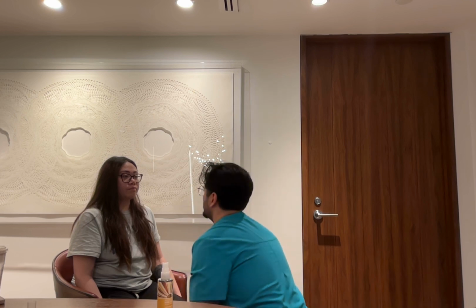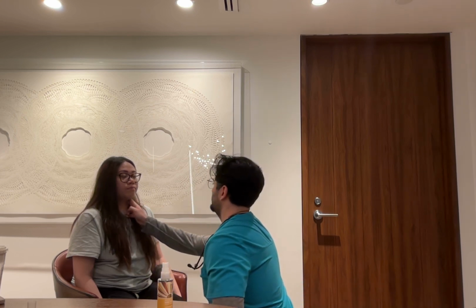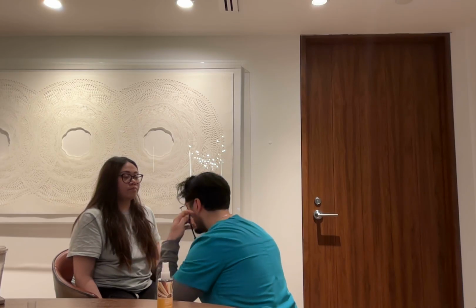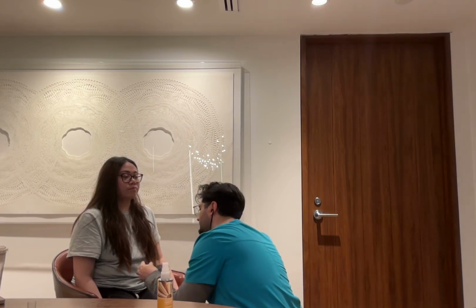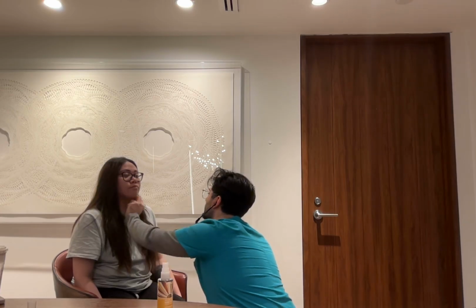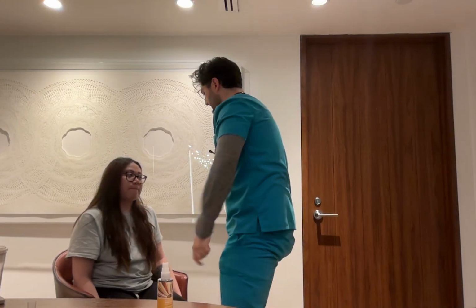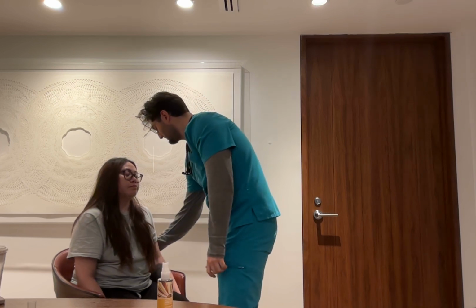No abnormal pulsations noted. Now I'm going to palpate them one by one. And pulses +2 bilaterally. And I'm going to listen for any bruits with the bell of my stethoscope, and just take a deep breath in when I place the stethoscope. No bruits noted.